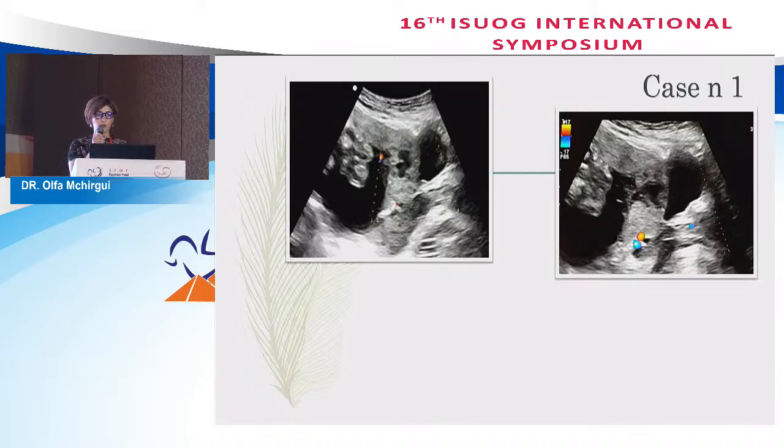And we start with our first patient, who is a 20-year-old female, para 2, consulting for vaginal bleeding at 26 gestational weeks. The ultrasound findings: there was an ongoing pregnancy with a low-lying anterior placenta, as you can see here. It's not showing the pointer.